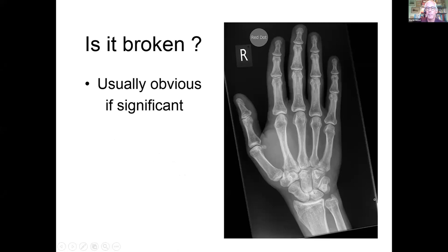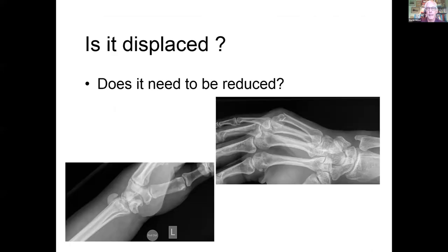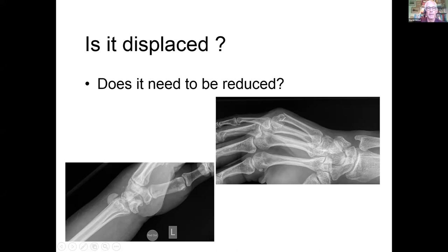There is actually a tiny fracture there — but it's completely undisplaced and completely stable. It doesn't need anything done about it; we can stop worrying about that. There's a clear fracture — but do we need to do anything about it? It'll heal up as it is. This fracture — actually part of the scaphoid — is completely displaced. The scaphoid's come out the back, the lunate's come out the front. That needs reducing, that needs something done about it. This is quite an easy fracture to reduce — you just pull on it — but it won't stay where it is, so you need to hold it there. Cross-K-wires is a good way of doing that.